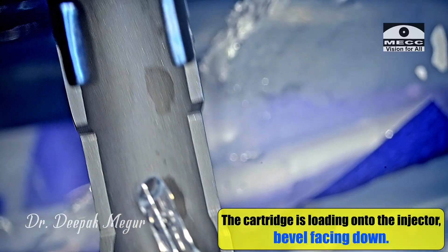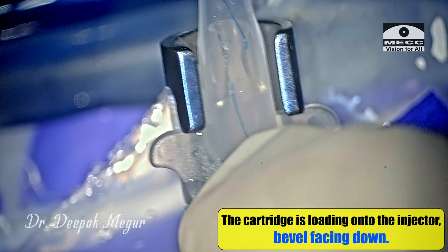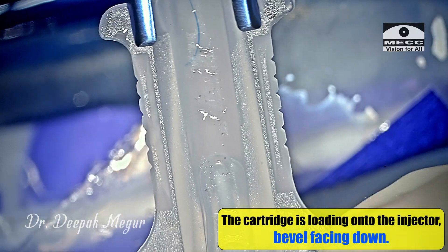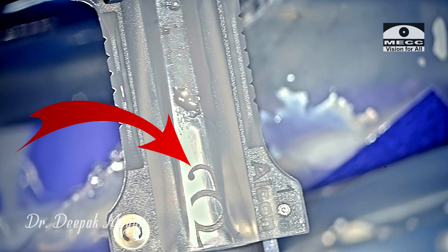The cartridge is now to be loaded onto the injector. Again the orientation is the same — the markings on the cartridge have to be facing the surgeon. It is loaded in and locked.